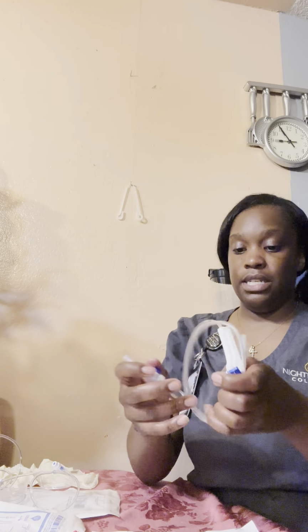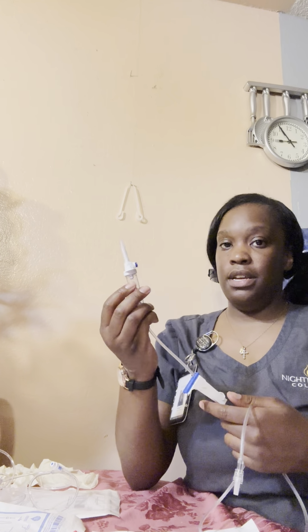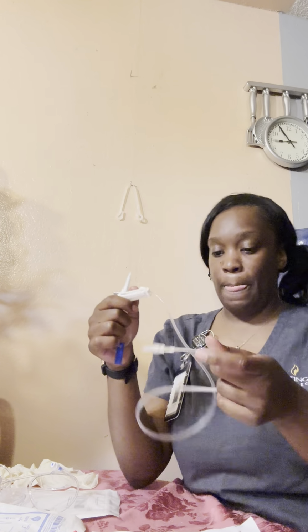So the second one has the same things. We have the spike, the drip chamber, the roller clamp, and this one does not have a Y site. It just has the adapter end.